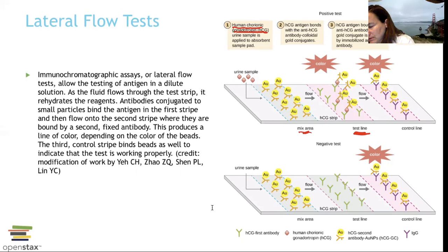When they capture this, they are going to coagulate, and it can either be antibody colloidal gold, where the gold is going to give you the red color, or the latex beads are going to give you the blue color. But we're going to get a color in this situation because the person did have the HCG that's captured by the antibodies, and then those antibodies stick onto the HCG first antibodies. So this is our lateral flow going on. So we got a sandwich going on.